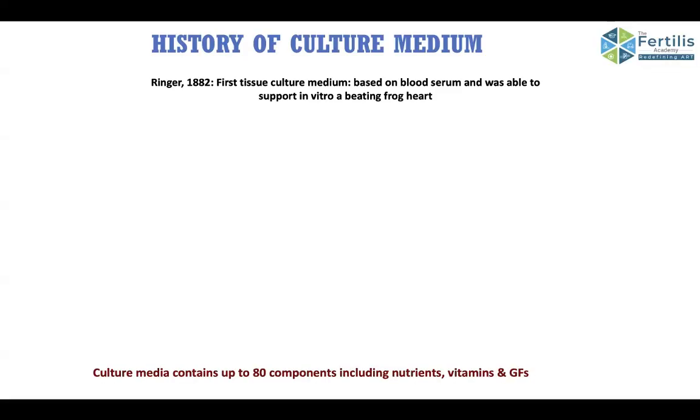Now, from 1882 to the present, culture media contain up to 80 components, including nutrients, vitamins, and growth factors. Dr. Lakshmi will be focusing on the micro components and the additives which have been added now, the hyaluron, growth factors, insulin-like growth factors. So many things she will be discussing in the next session.